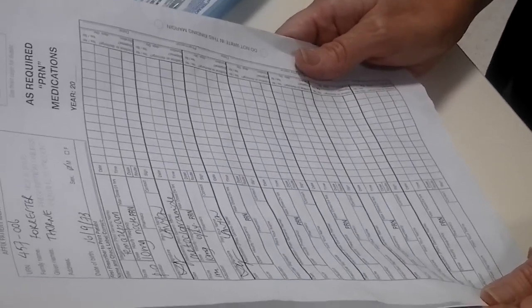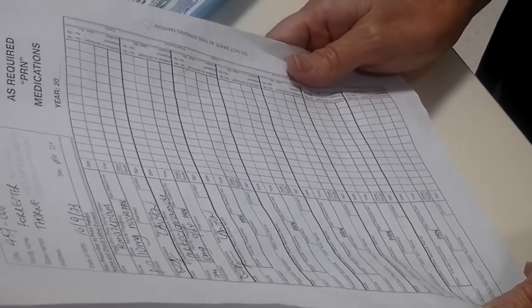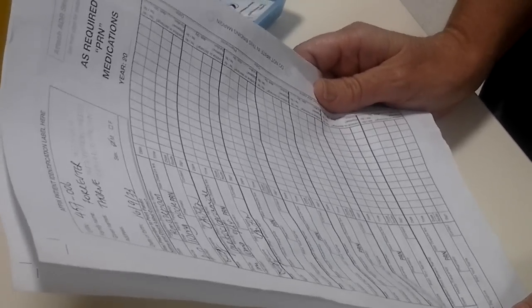Undertaking an intramuscular injection. Step 1. Identify the reason why you are giving the injection. This is Thorne Forrester. He is having metoclopramide because he's been nauseated. Identify the 6 rights on the medication chart.